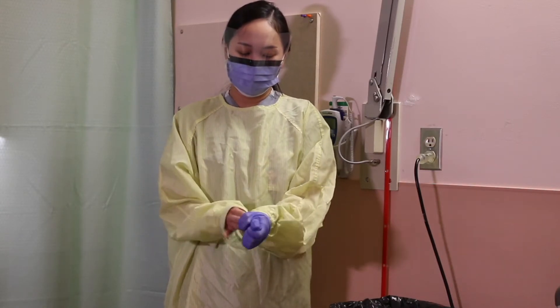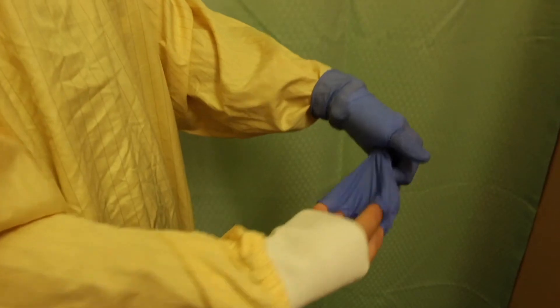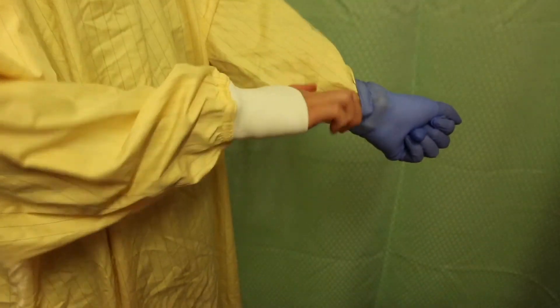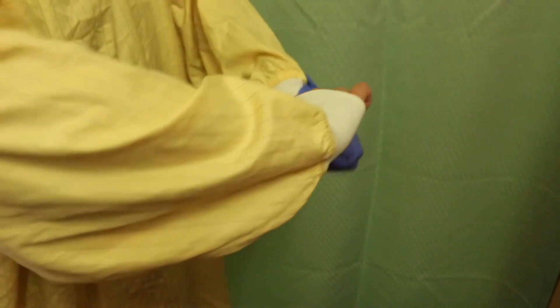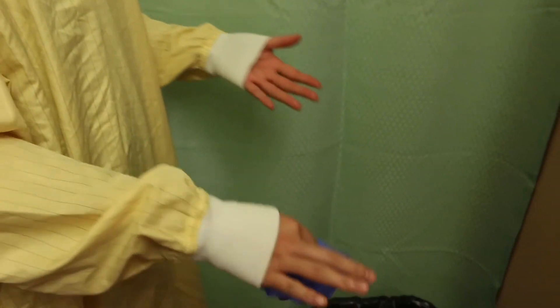Remove gloves first using a glove-to-glove, skin-to-skin technique. Grasp the outside edge near the wrist and peel away, rolling the glove inside out. Reach under the second glove and peel away. Discard immediately into waste receptacle.